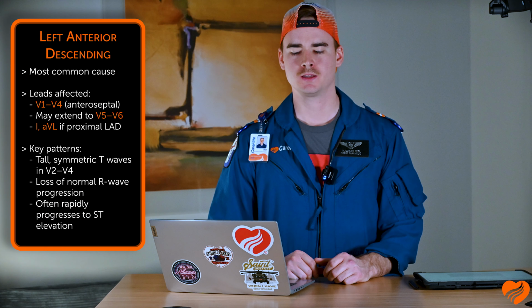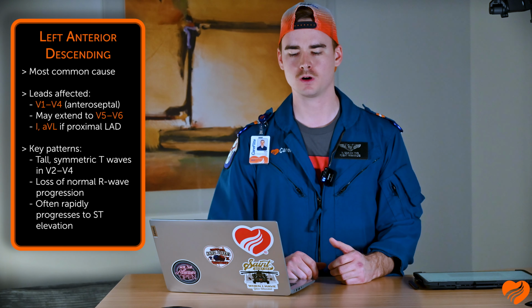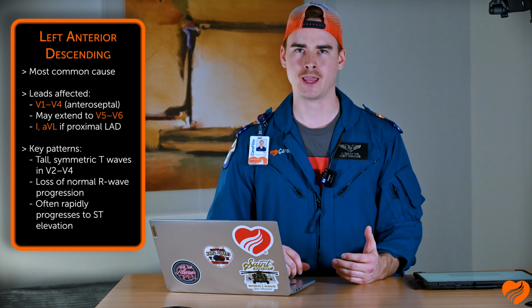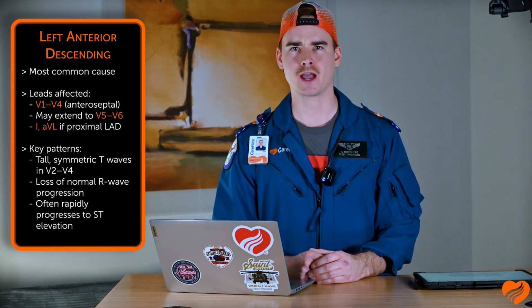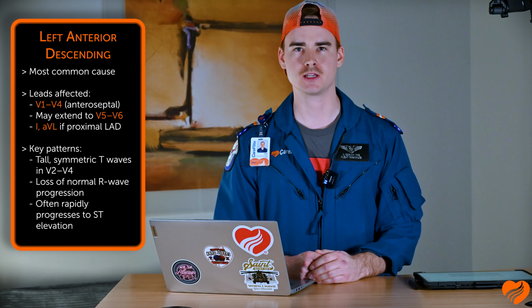Now we can get into specific coronary arteries and how they present with these hyperacute and dynamic T wave changes. With your LAD, most commonly affected leads are your precordial leads, V1 through V4, and these may also extend all the way to V5, V6. aVL also if proximal LAD, and oftentimes seen with your De Winter pattern. Key patterns with the LAD is loss of normal R wave progression, and often rapidly progresses to ST elevation.